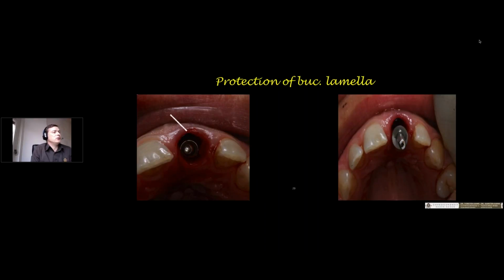Making a small implant, you see you have a big gap between the bone and the implant. Put the implant, if you have a rough surface, at least as you see with this Tri implant, 1 millimeter below the bone height of the proximal side. But if you have a very big loss of the buccal bone and soft tissue, then you have to go a little bit deeper.